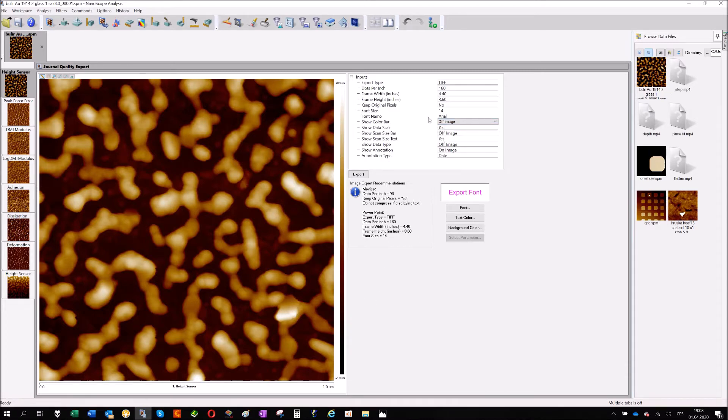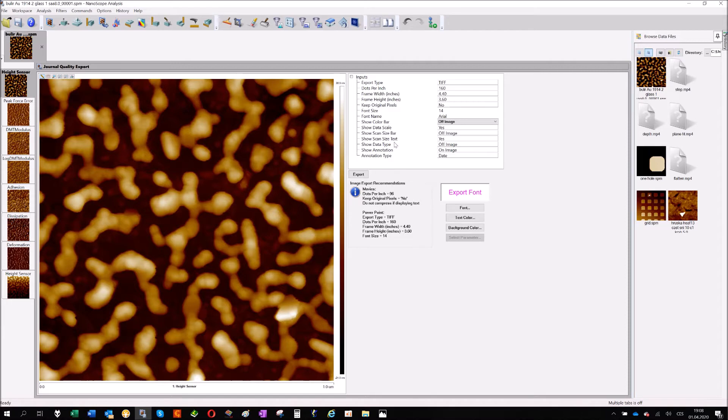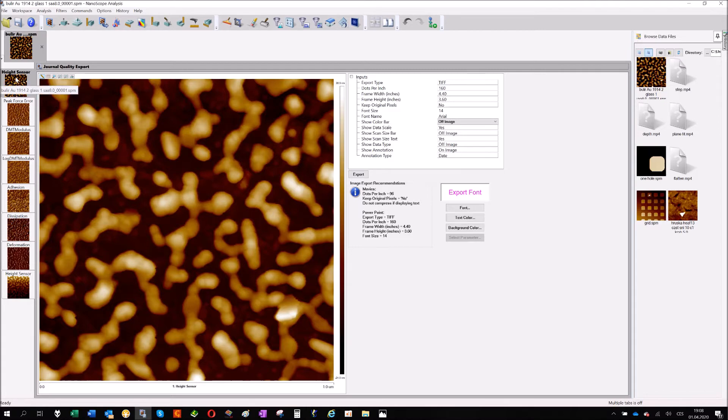So what kind of information you can have: data scale, the scan size, not only the bar also the text, that's the kind of information. The kind of the sensor, so for AFM it's height, actually height sensor information.